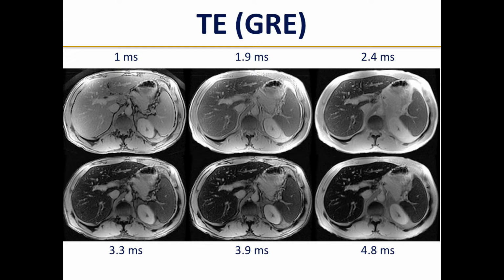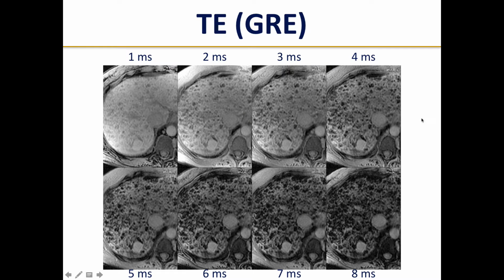And the answer is B, transfusional siderosis, because we see iron accumulation in reticuloendothelial organs such as liver and spleen and bone marrow, but we don't see it in the pancreas. If we had seen it in the pancreas but not the spleen, we'd be thinking hereditary hemochromatosis. And this is an example of someone who has a different kind of iron overload. This iron overload is due to chronic hepatopathy.